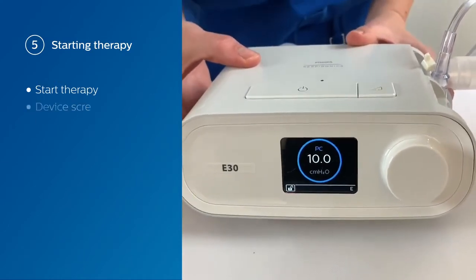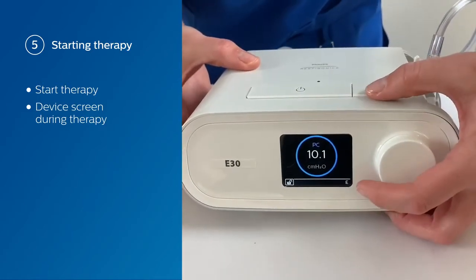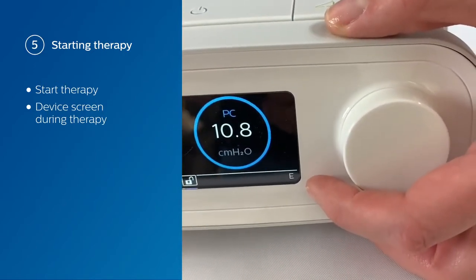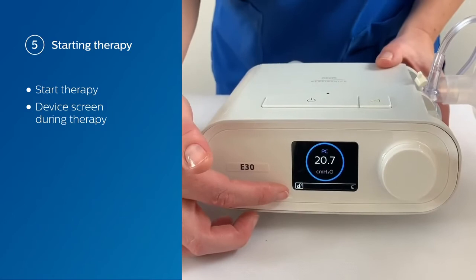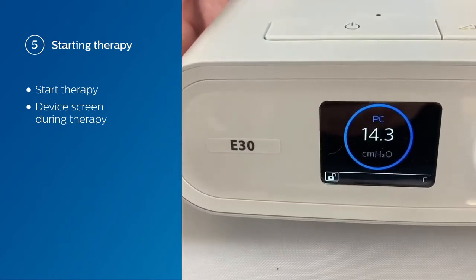As you can see from the screen, we're in PC or pressure control. In the bottom right-hand side, you're going to see either an I or an E — an I is when you're in IPAP for inhalation, and an E is when you're in EPAP for exhalation. On the bottom left, you've got the unlock symbol, which shows that you are in the provider-clinician screen.